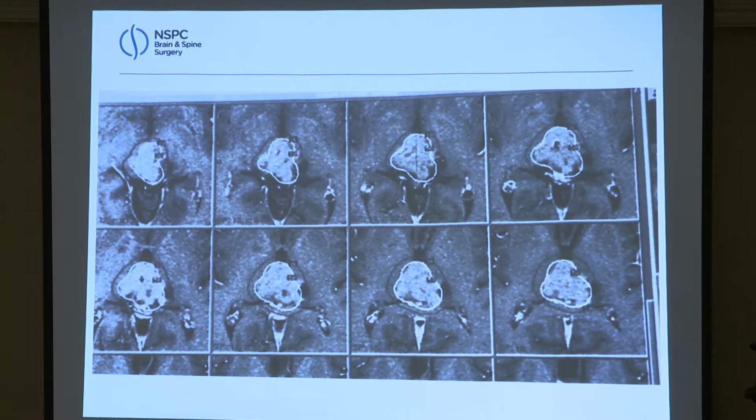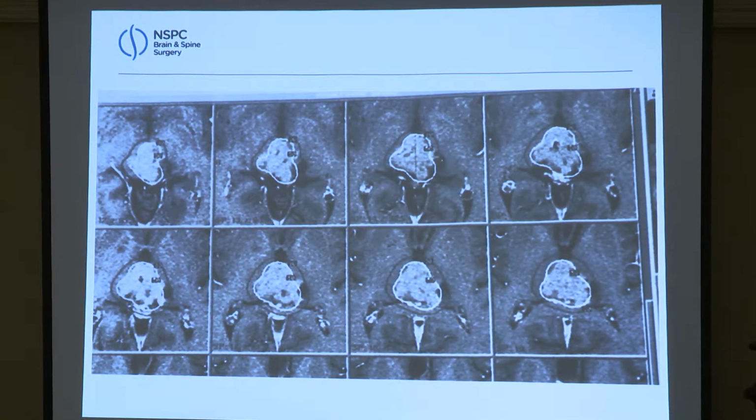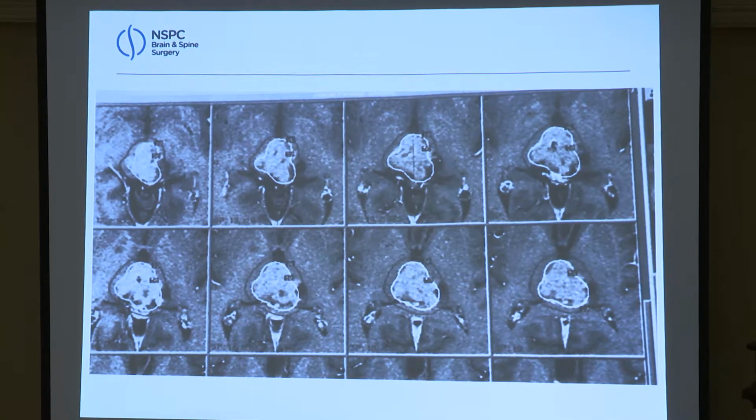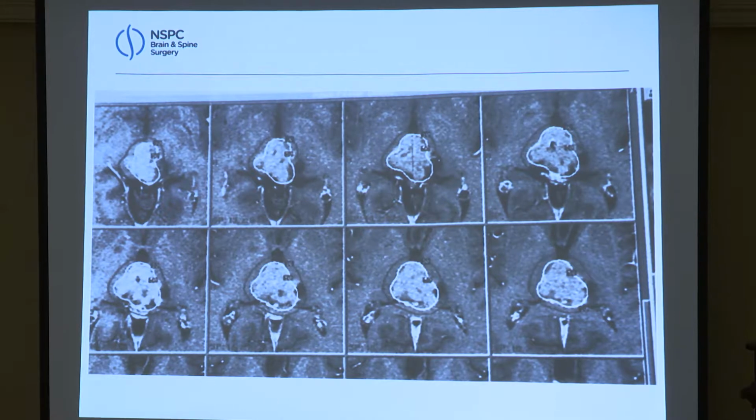This is a very irregularly shaped mass, and with Gamma Knife and with some of the modern radiosurgery techniques, we can contour the radiation to exactly what we want. We don't want this. A spherical treatment would be very unsatisfactory, and the hot spot might be twice what it is if we could be tight to the tumor and conform the radiation exactly to where the tumor is. So the first point is a very conformal treatment of an irregularly shaped tumor.